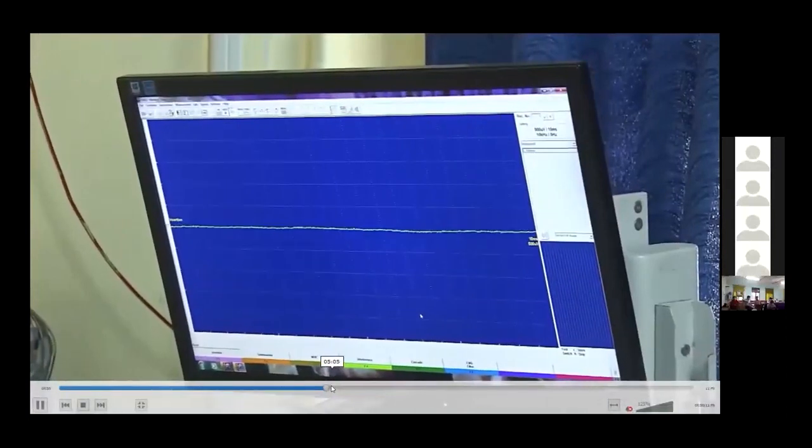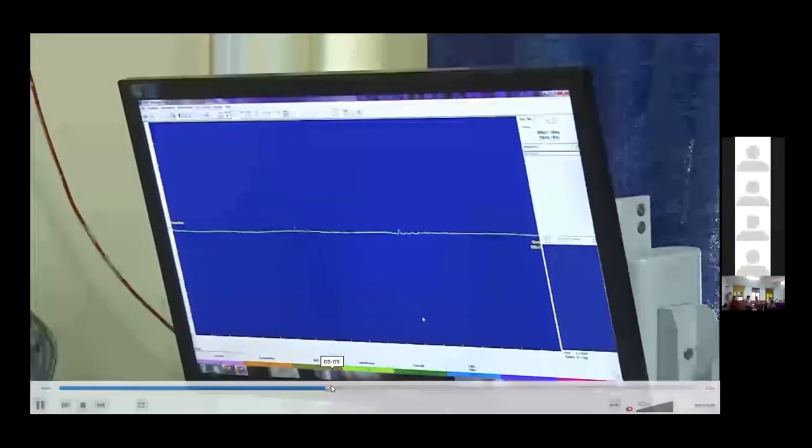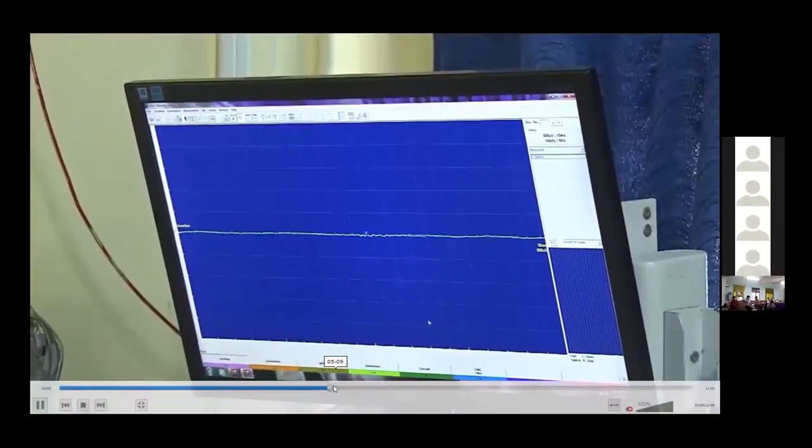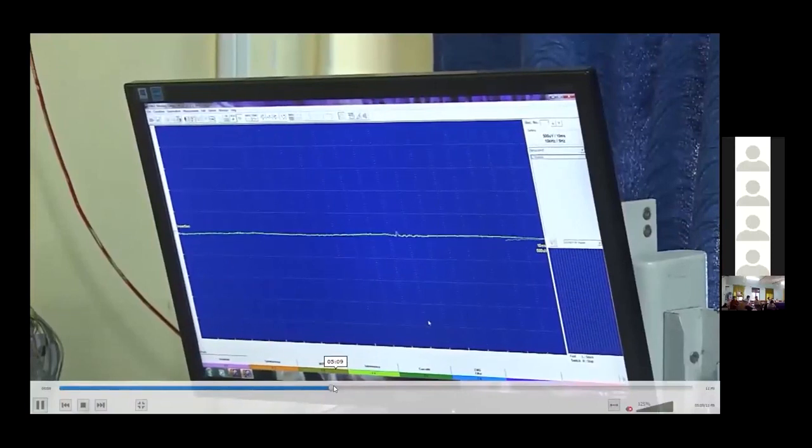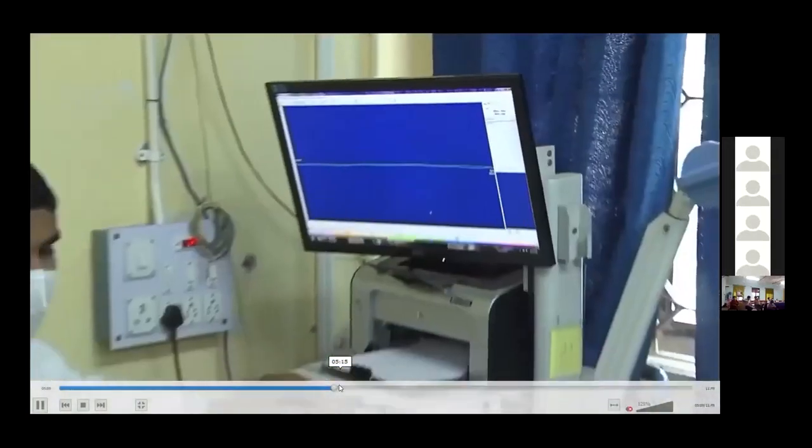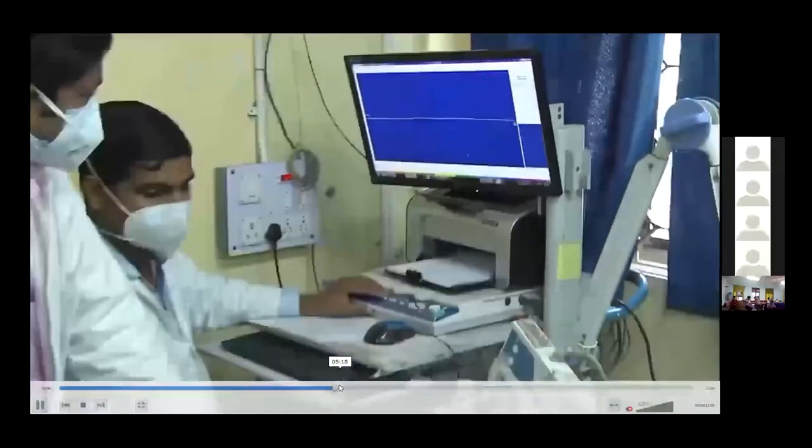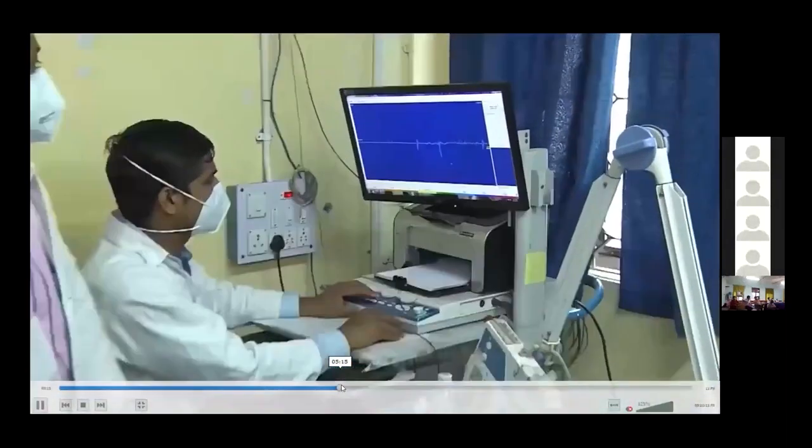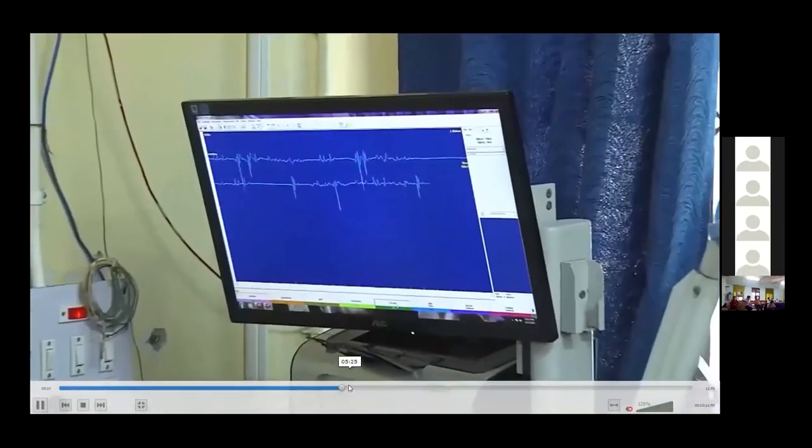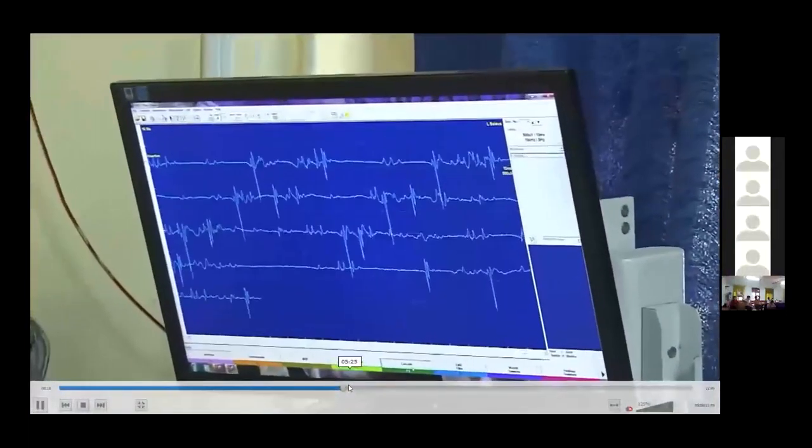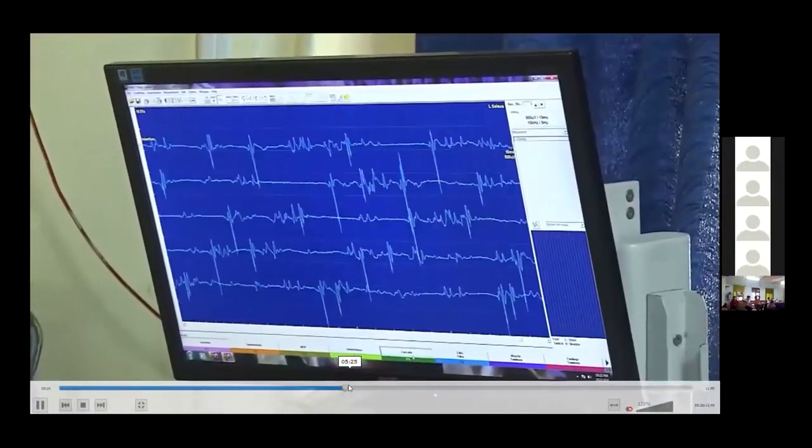The baseline is being stabilized. Now we will look for any spontaneous activity. We have to wait for actually three minutes. But often in children, they don't allow us so long. So here, this is seen in cascades or rasters.